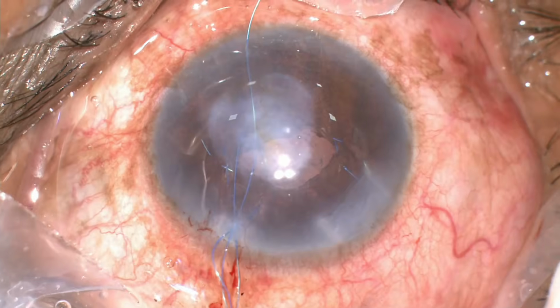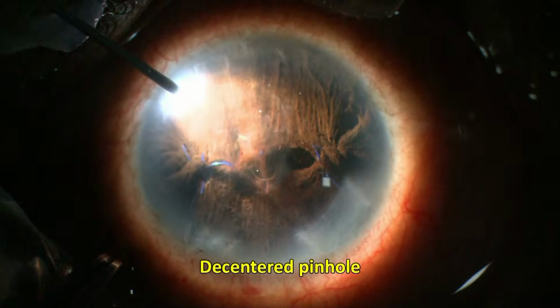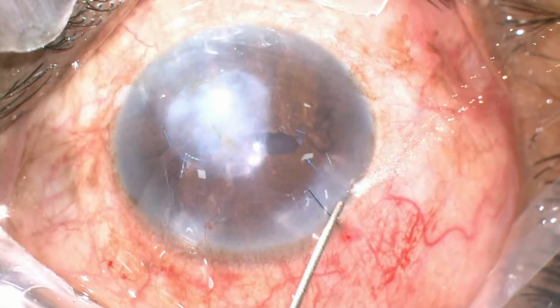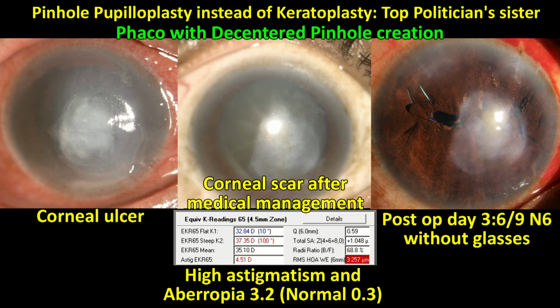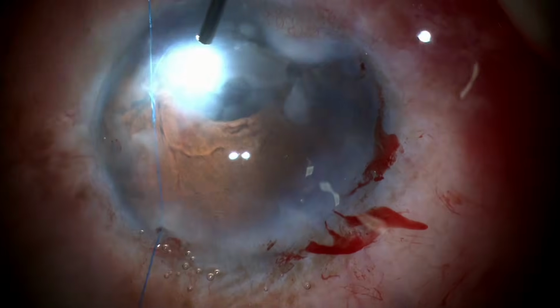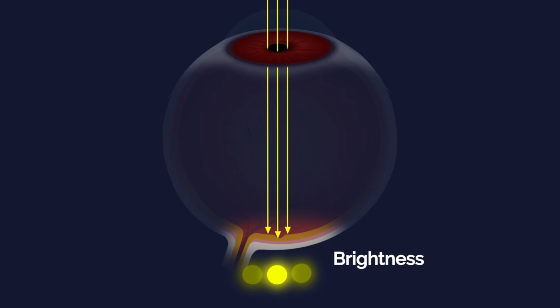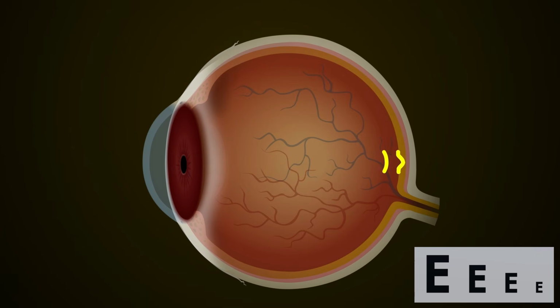The principle behind decentered PPP is based on optical refinement and neural adaptation. By reducing the angular spread of incoming light rays, the pinhole pupilloplasty minimizes the blur circle, and over time, the photoreceptors functionally adapt to the new optical pathway. Its advantages are significant. It eliminates the dependence on donor tissue, is technically efficient and reproducible, enables rapid and predictable visual rehabilitation, and requires minimal postoperative therapy. Pinhole pupilloplasty shifts the focus from structural replacement to optical optimization, offering visual restoration through precise control of light.